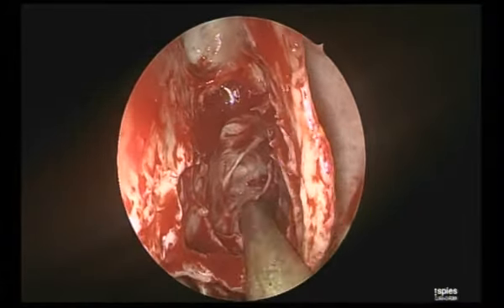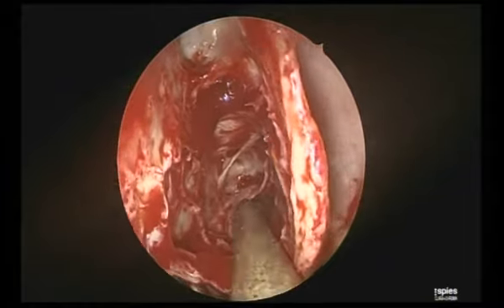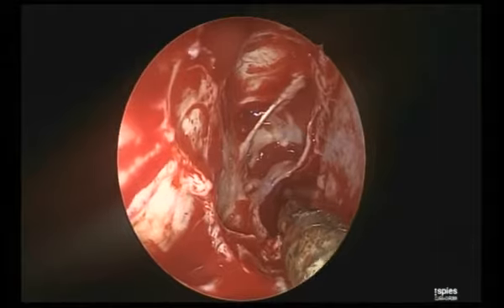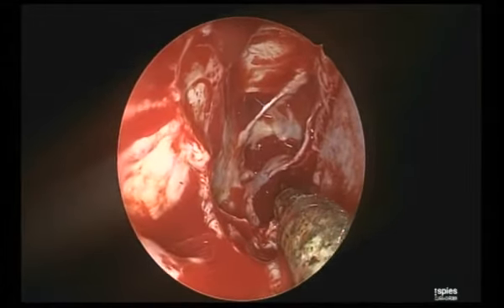This is bleeding, it will stop. Even if I don't coagulate, believe me, it will stop. But the simplest way is touch.